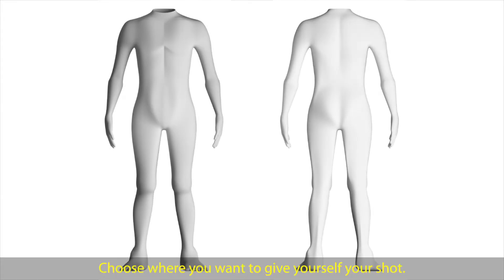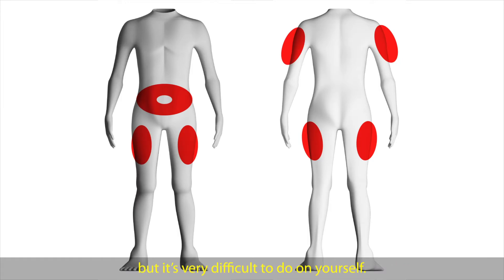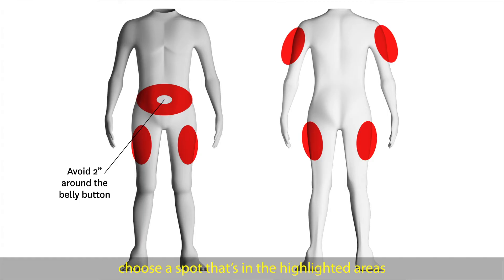Choose where you want to give yourself your shot. Good options include the stomach and thighs. You can also do a sub-Q shot in the back of the arm, but it's very difficult to do on yourself. If you want to do your shot in the belly, choose a spot in the highlighted areas that is at least two finger widths away from your belly button. If you want to do your shot in the leg, choose a spot in your upper outer thigh.